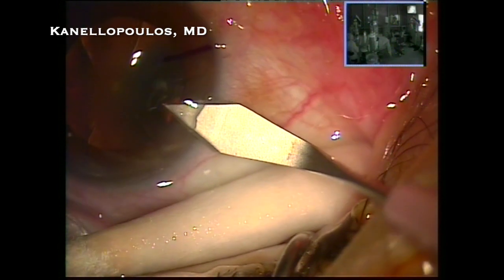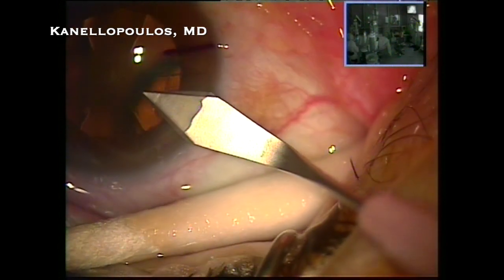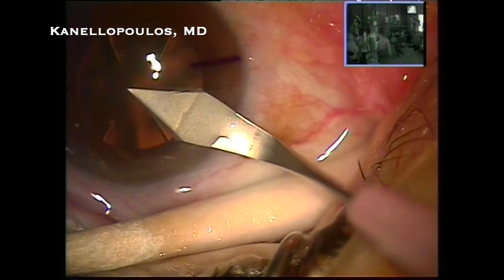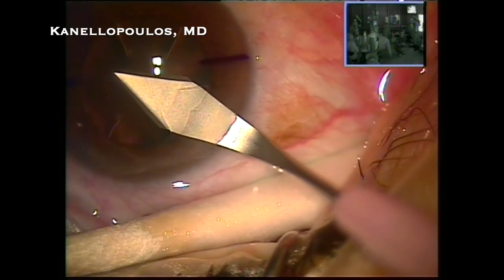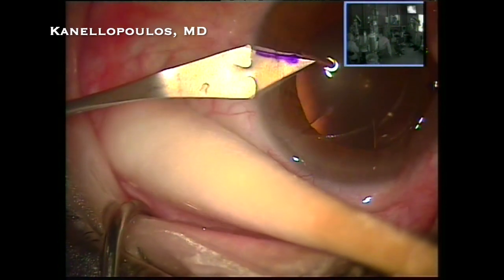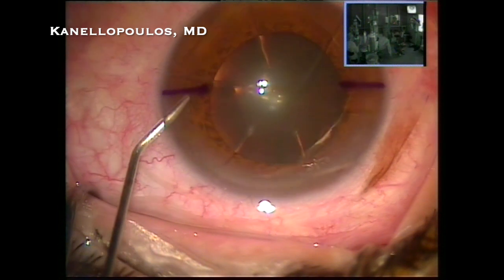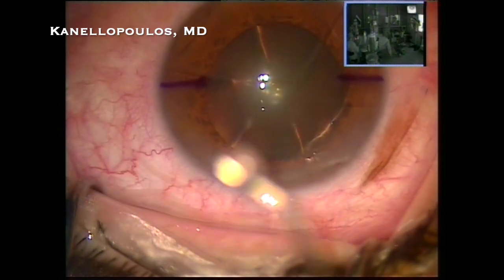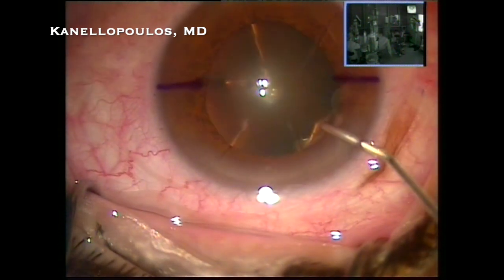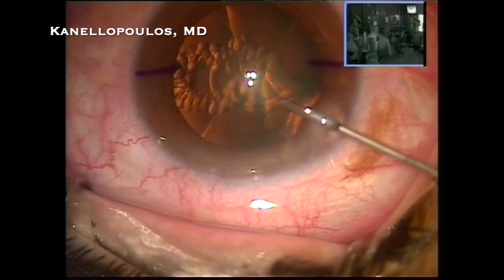Now, remember, this is my main incision. A key pearl here is I'm going to try and go between the two RK incisions and avoid intercepting them — otherwise I'm going to have a gaping wound.